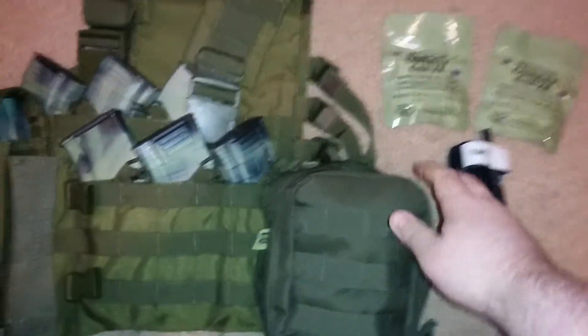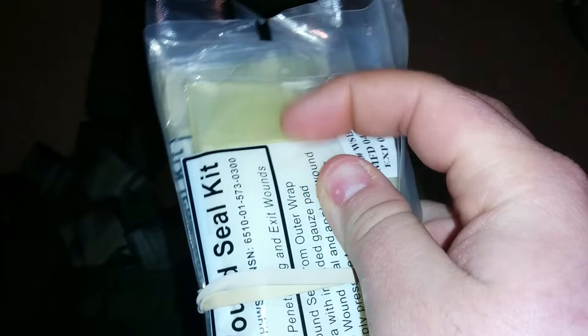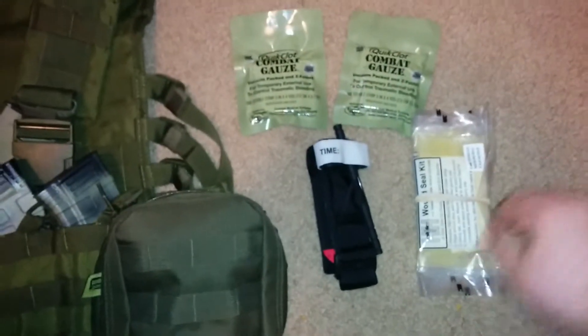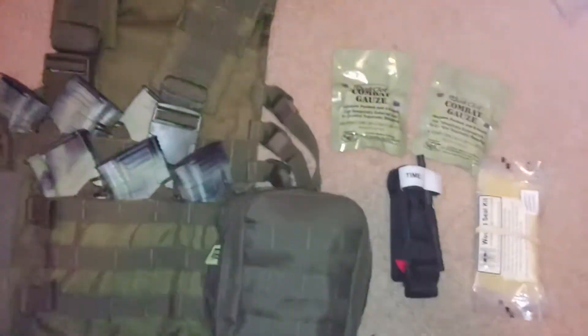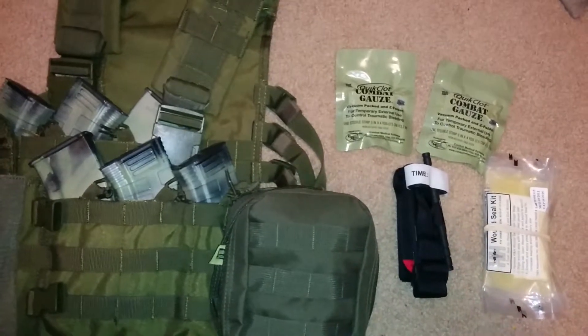Next, there are two chest seals in here. In case you get hit in the chest, you slap one of these on — there's a sticker-type backing you peel away — and you stick it on a bullet wound or even a stab wound to the chest so it doesn't cause a sucking chest wound.